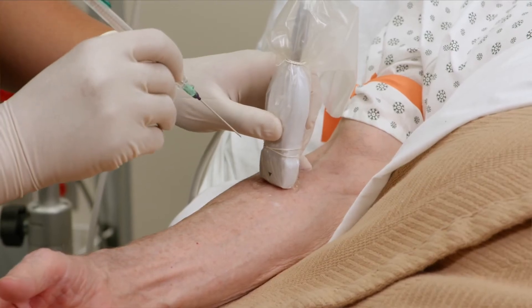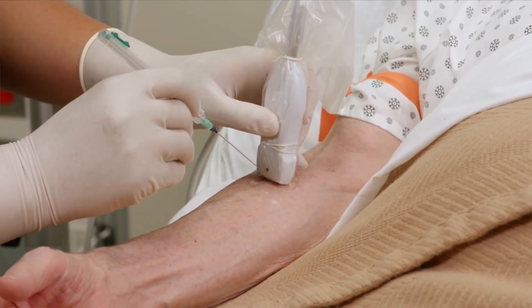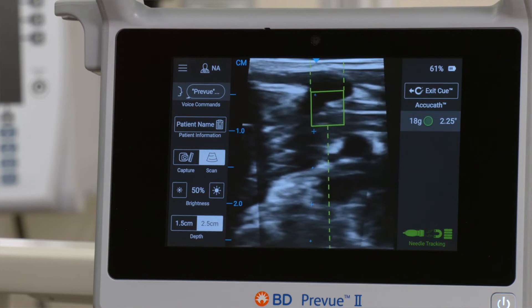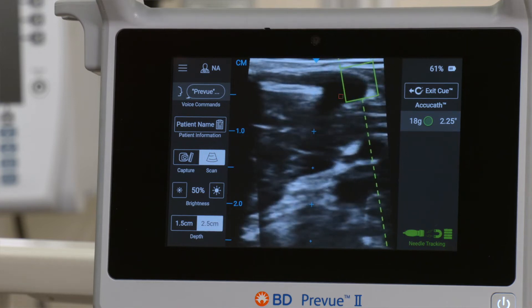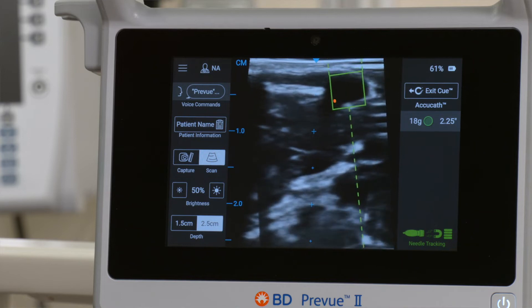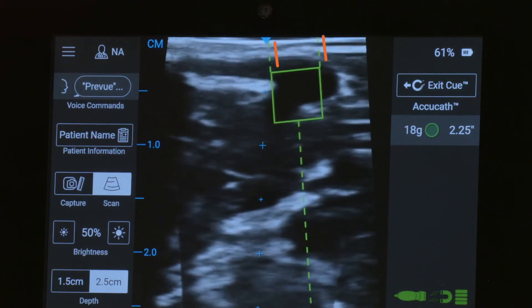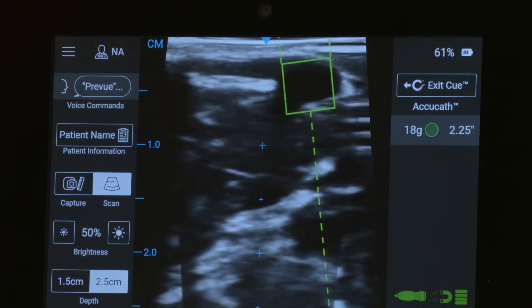With the needle cap removed, slowly introduce the needle to the probe at about a 45-degree angle until the overlay appears on the screen. The Q overlay consists of three elements: one, the target box; two, the needle trajectory; and three, the needle location, or where the needle tip is located.